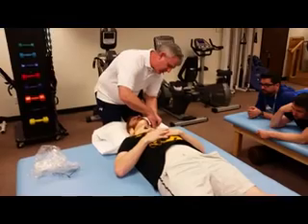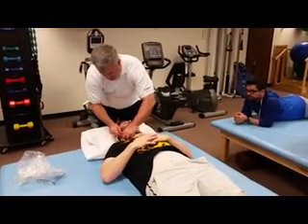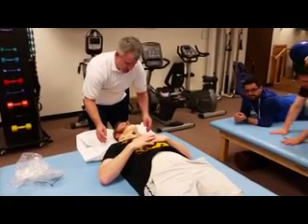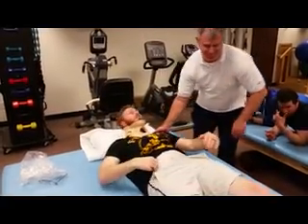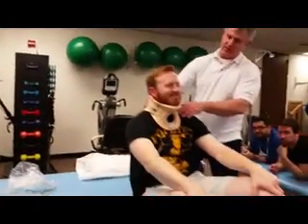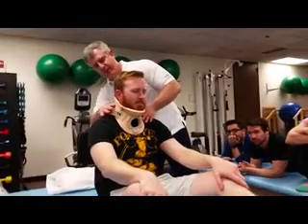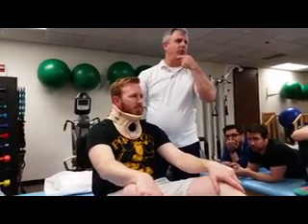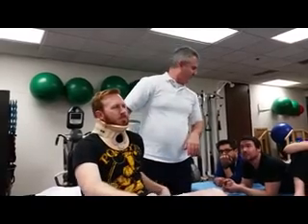Most likely I'm going to have to readjust once he's sitting upright because it's probably not as tight as I need it to be, but I can adjust one side and the other. Can you breathe? Can you move your chin? A little bit? All right, I'm going to have you sit up. So it looks pretty good, and I got it pretty tight. He can chew a little bit, but his chin is resting on that low resting area. It's nice. It's supposed to be comfortable.